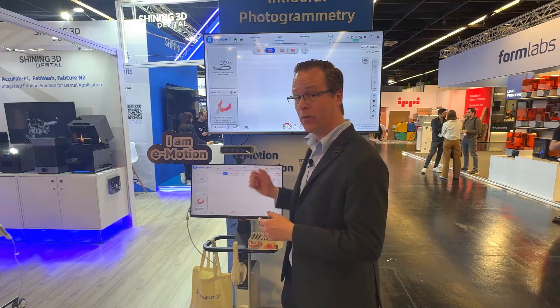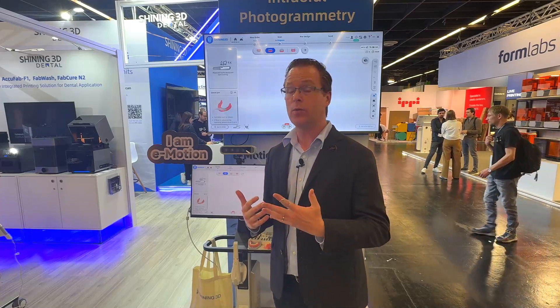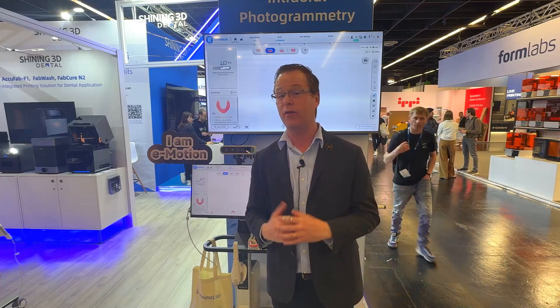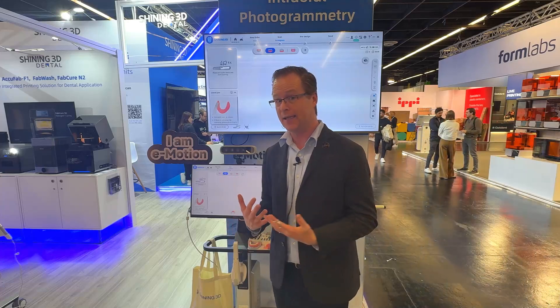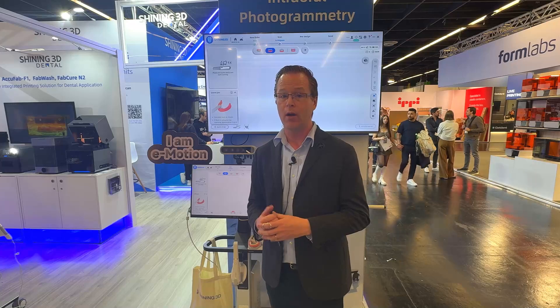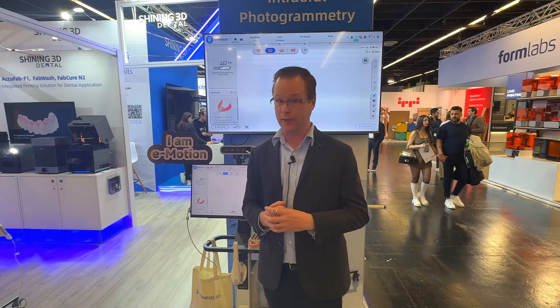What I've wanted to go ahead and demonstrate is a scan for a dentureless workflow, since so many of you know me for overdentures, dentures, and things of that nature. Let's jump right into doing a live scan here with our Shining 3D Elite wireless scanner.